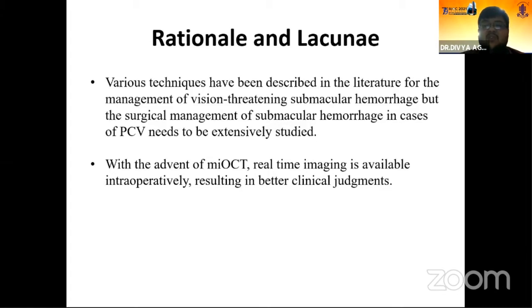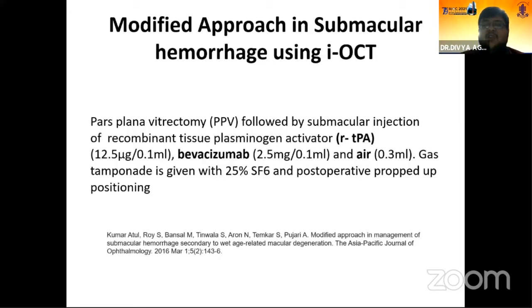With the advent of intraoperative OCT, real-time imaging is available, which gives us better clinical judgment as well as better real-time updates of the procedure we are performing. I'll be showing you a video of a modified technique.